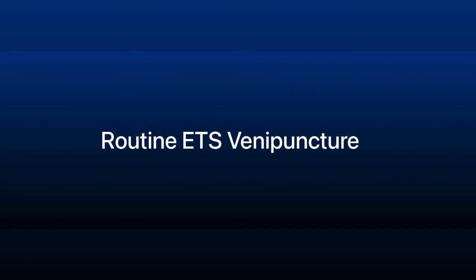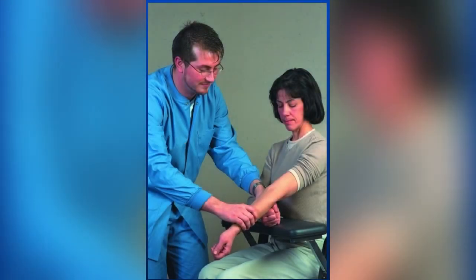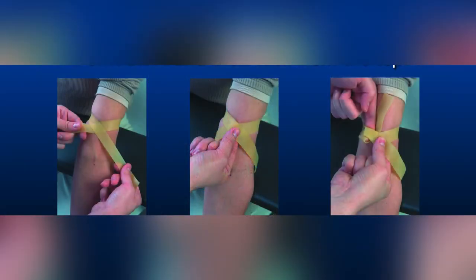Routine ETS venipuncture. Review and accession test requests. Approach, identify, and prepare patient. Verify diet restriction and latex sensitivity. Sanitize hands. Position patient, apply tourniquet, and ask patient to make a fist.